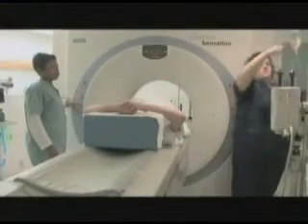Besides cardiac CT, other imaging modalities have improved our ability to diagnose and manage cardiovascular disease. Among others, cardiac MRI has become one of the most important tools for today's cardiovascular specialist. It is a perfect replacement for echocardiography for patients with poor windows, also for patients that cannot tolerate TEE.